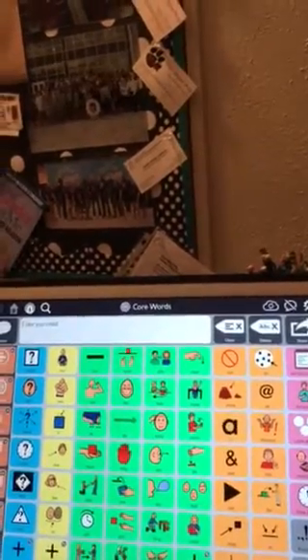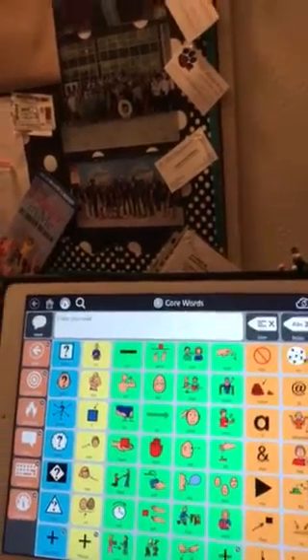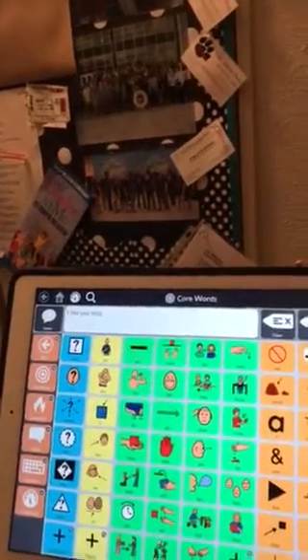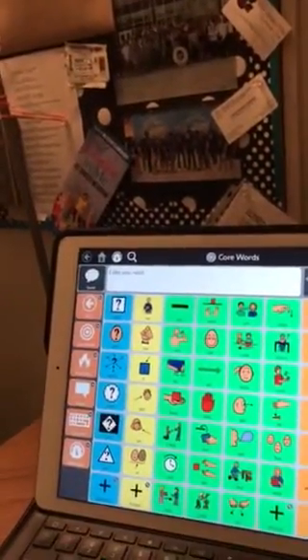The one limitation I do have with my kids is the ability to type what they want, because sometimes they'll say things that are rather inappropriate when they are upset, and then it can be broadcasted through the entire room, which they find funny to hear through the robotic voice instead of their own voice. So that's one small limitation to it.